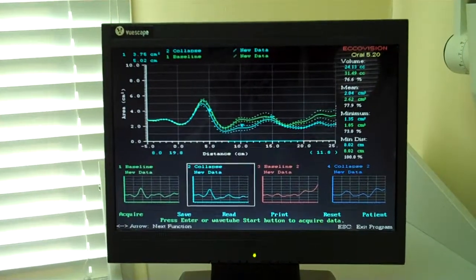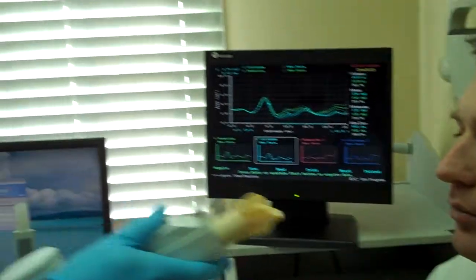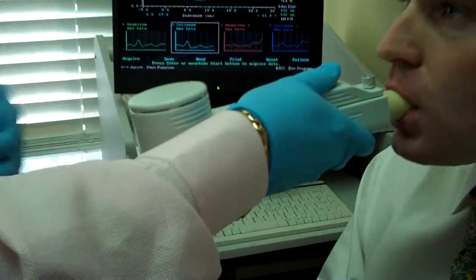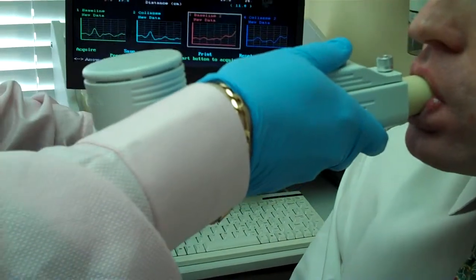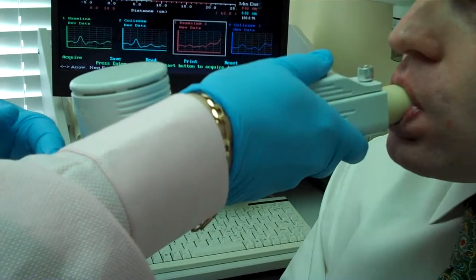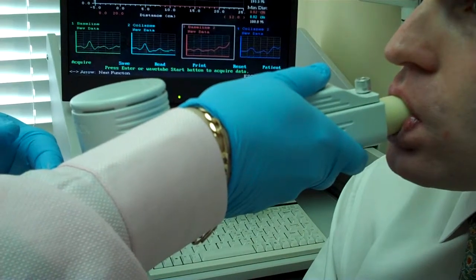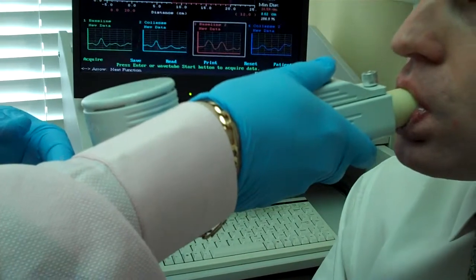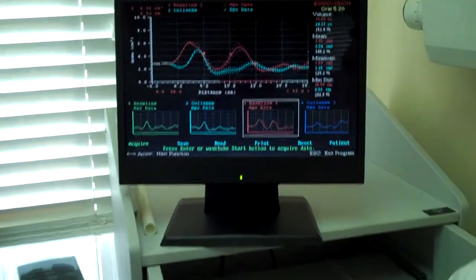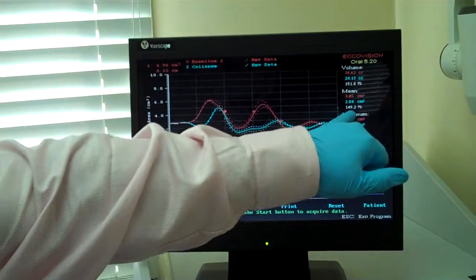Then what we can do is test to see what effect an oral appliance might have on this process. So go ahead and put your tongue underneath there. This time just move your jaw very far forward and go ahead and take a nice breath in and breathe all the way out. And let me know when you can't breathe out anymore. Good. And what that shows us is that when he moves his jaw forward, he has a much larger airway, on average 50% larger, 49% larger than when his jaw is hanging backwards.